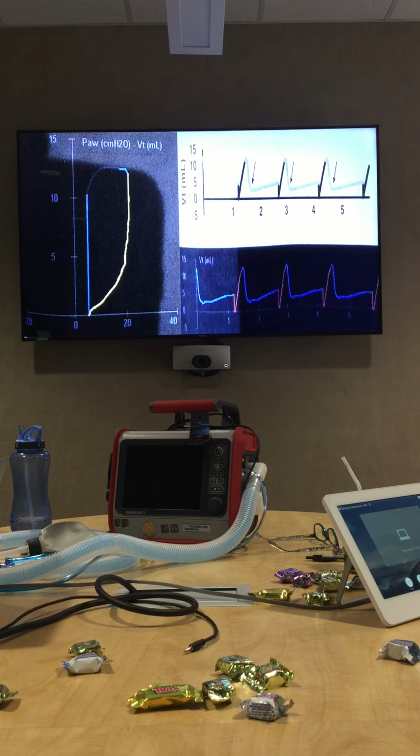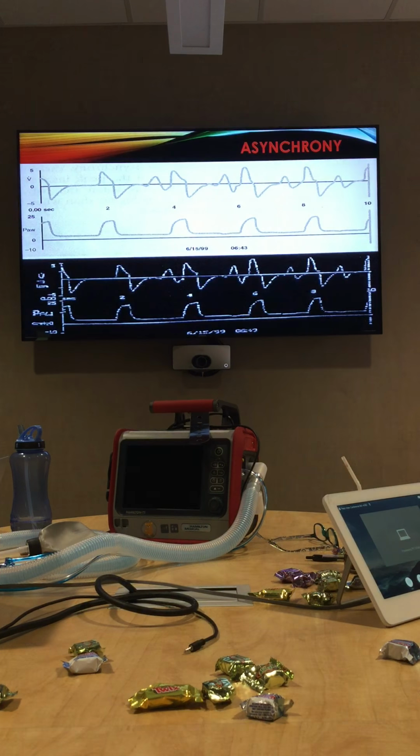At least for now. And just so you know, the Drägers do have a mandatory minute ventilation, almost the same concept that the Hamilton uses, so we could almost set one the same way as we're bringing a patient in. It's not something that's typically used here too much, but Dr. Pantikar and Dr. Damon are both on board for using the Hamilton. They've done some of the videos just like you did, and they did ask for those classes, so they are aware of all the changes that are going to occur there.